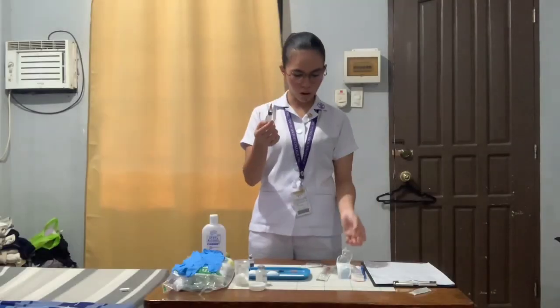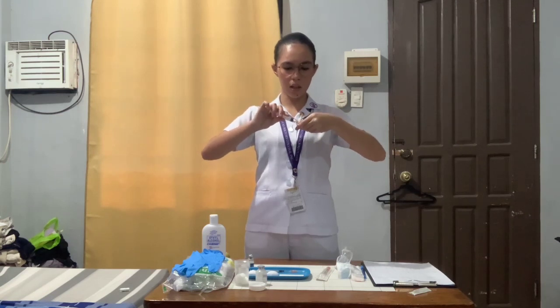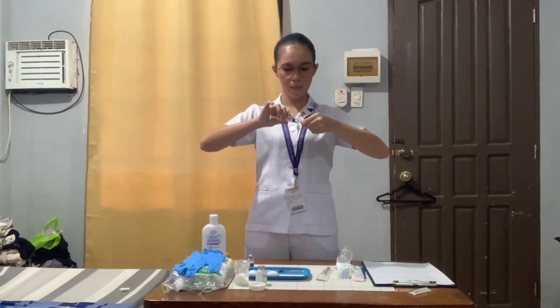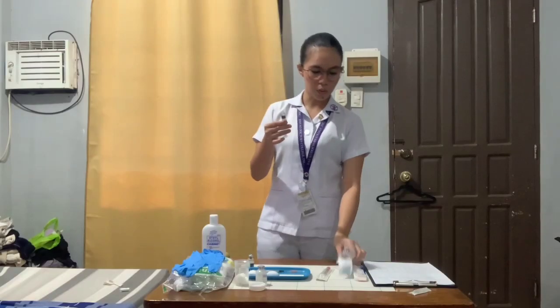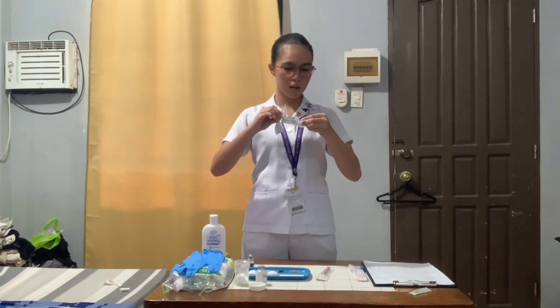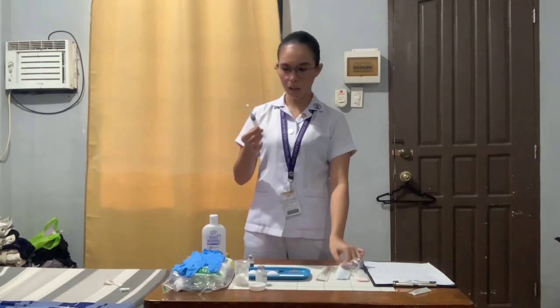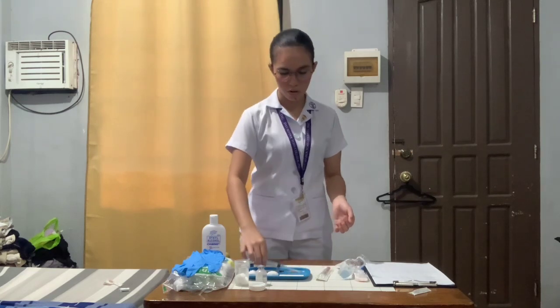So after that, we are going to cap the filter needle, and then we are going to unattach it, and then we are going to attach back the barrel to the right size of needle tip. So now that this is ready, we are going to put this also on our hypodermic tray.